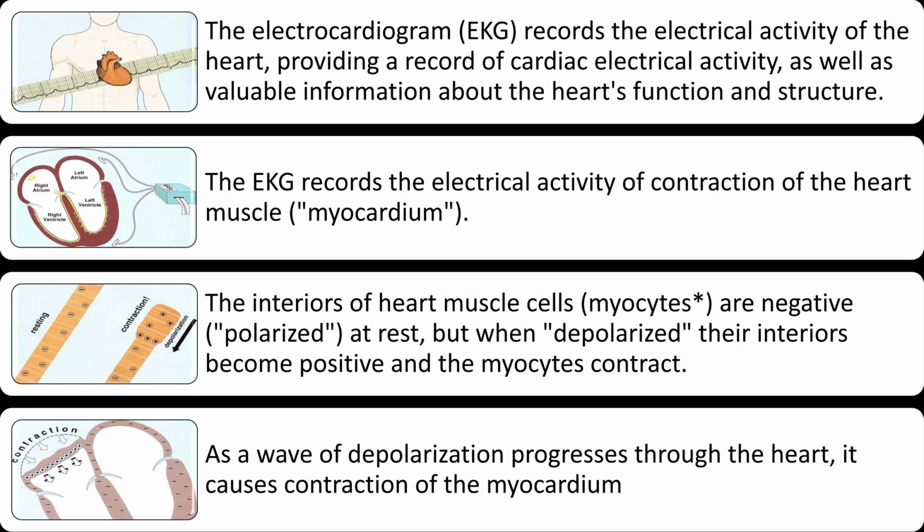The electrocardiogram, EKG, records the electrical activity of the heart, providing a record of cardiac electrical activity, as well as valuable information about the heart's function and structure. The EKG records the electrical activity of contraction of the heart muscle, myocardium.